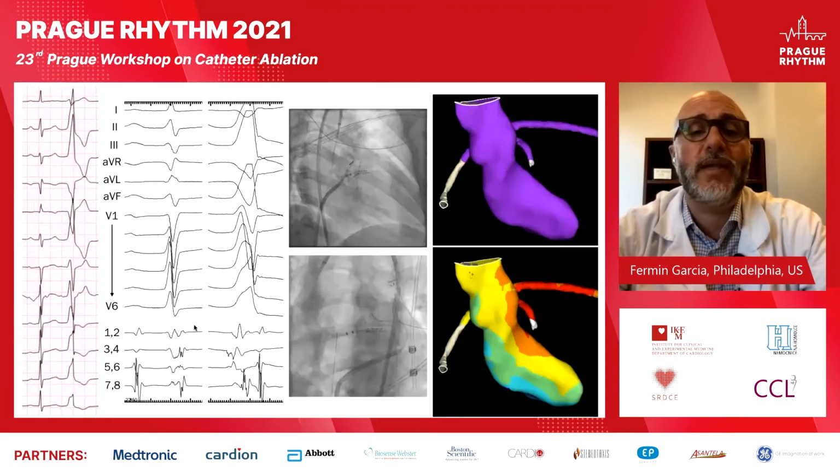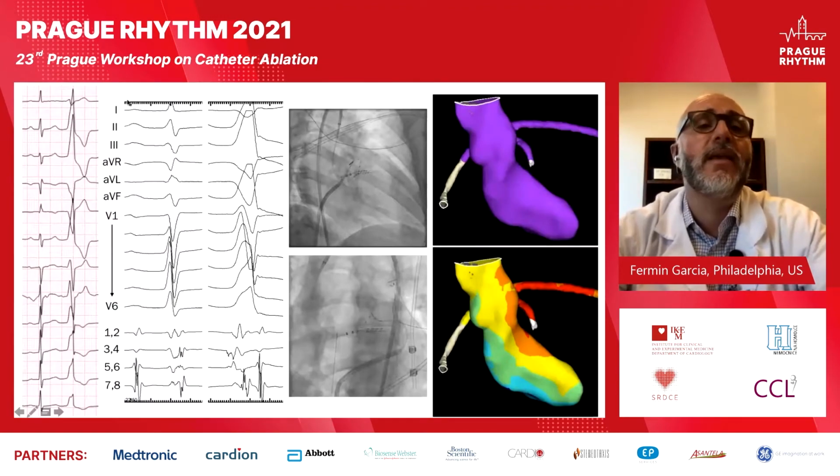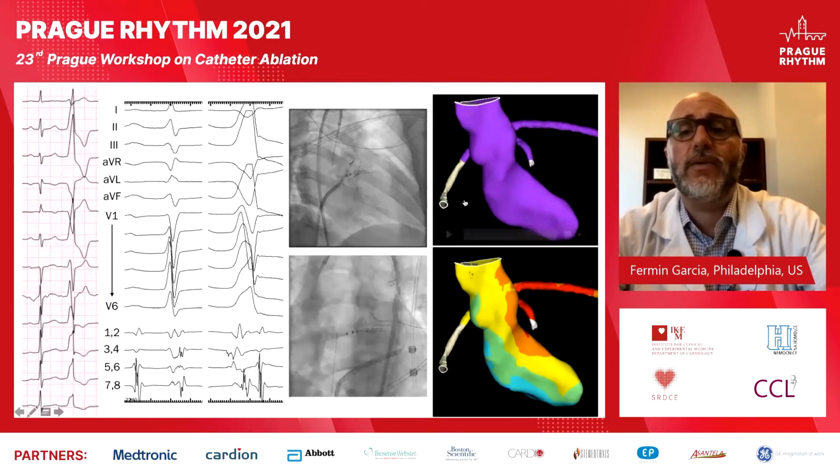for this. So it takes us to this case, and this is, I think, the realization. In our series at this point, 10% of failed PVC ablations have this pattern. This is another case of a left ventricular outflow tract PVC, a similar thing, a little bit of pattern break on V2. And we have here activation in sinus rhythm and activation with the wire. So what we have decided to do is to perform full activation mapping of the endocardium, the venous perforator, and the epicardium. And you can clearly see here now a completely different pattern of activation.